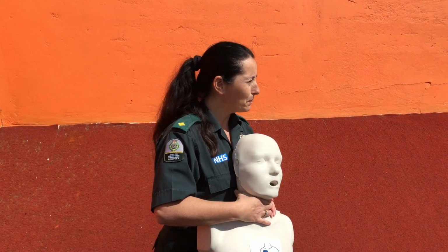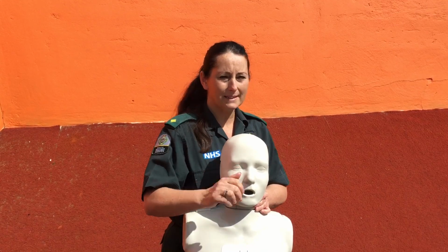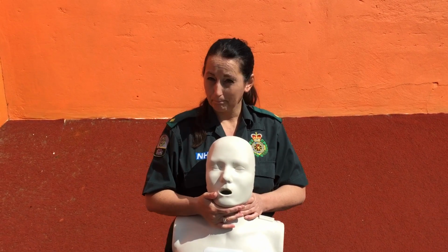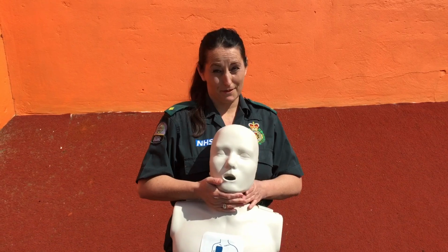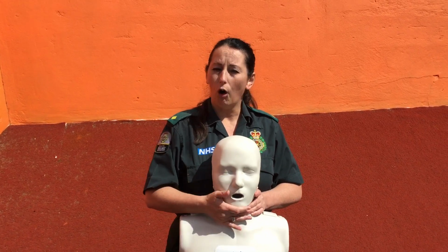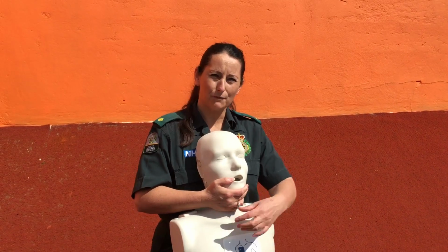And how many hands CPR do you think you use? One, yes. One-handed CPR for a child. Up to what sort of age would you think? That's between 1 and 8. What would you do if you didn't know what age the child was? You've got to guess the age of the child, and you're not going to do any harm. Where you position the pads is just about how effective the shock would be for that child.